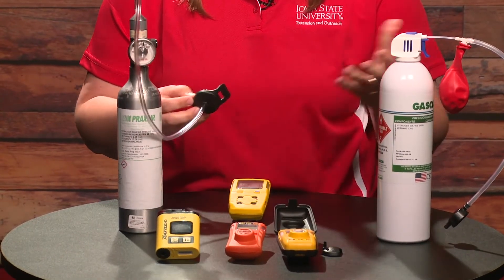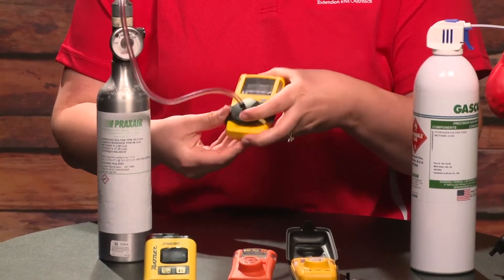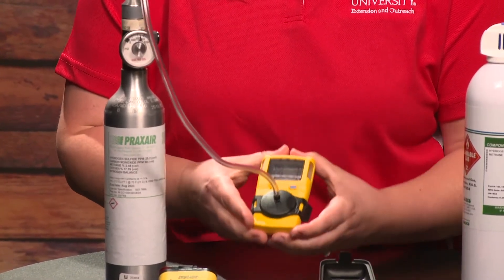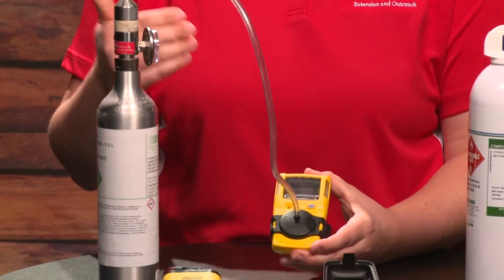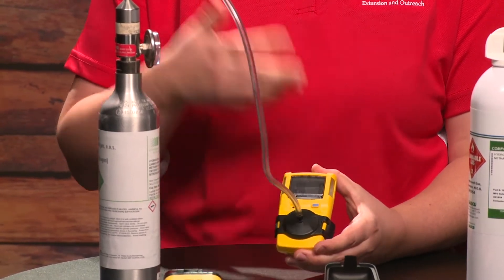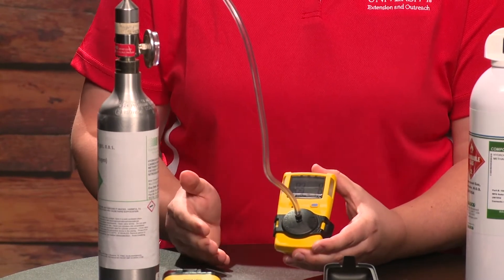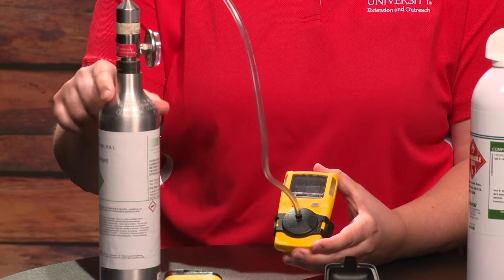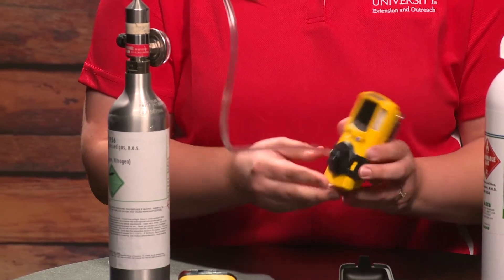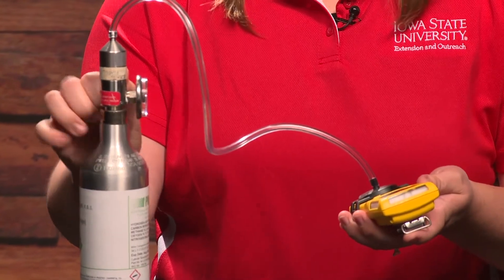With the monitor on, I'll connect the calibration cap, which takes a good push to snap on. Then I'm going to turn on the gas and watch to see if we're hitting the alarms at the right time — usually 10 or 15 parts per million hydrogen sulfide — and see how long it takes to reach the concentration of the gas, which is 25 parts per million. I want to make sure that happens fast enough. So I'll turn the gas on and see what happens.